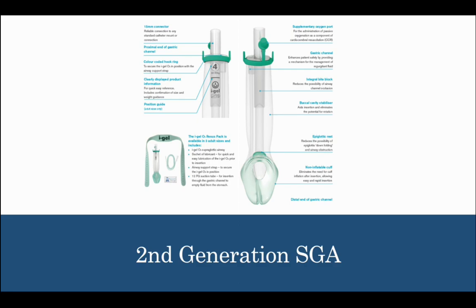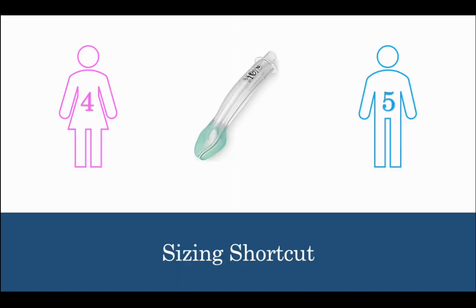Keep in mind, most manufacturers don't have the right size OG tube for the device you have. So as you're doing your rig checks, take a look at your iGels and what size OG tubes each of them need, and see if you have them on hand, because in a pinch, you don't want to have to be searching for these.